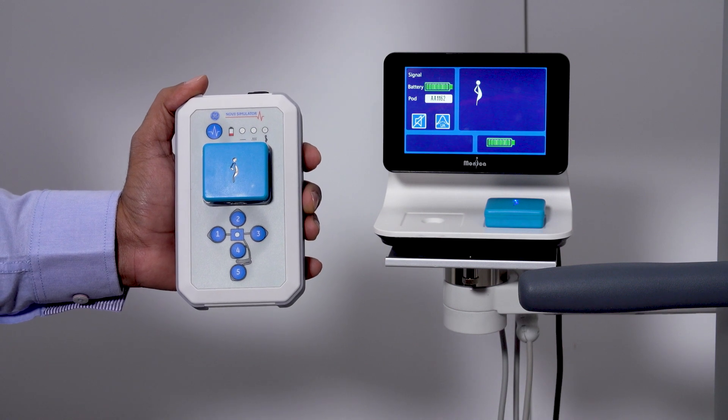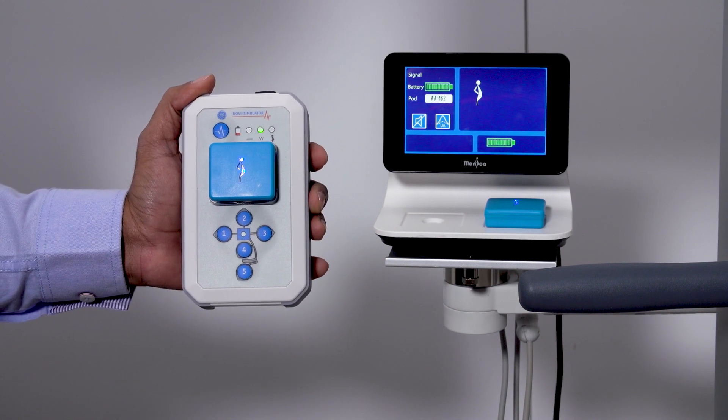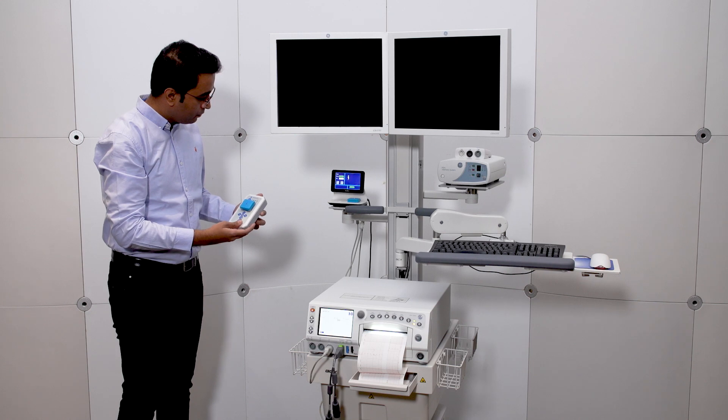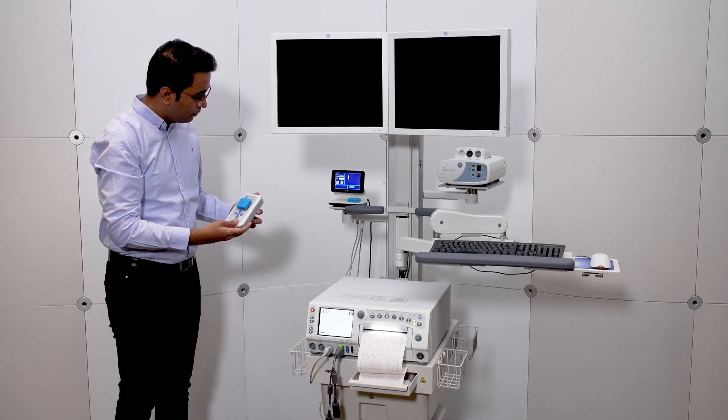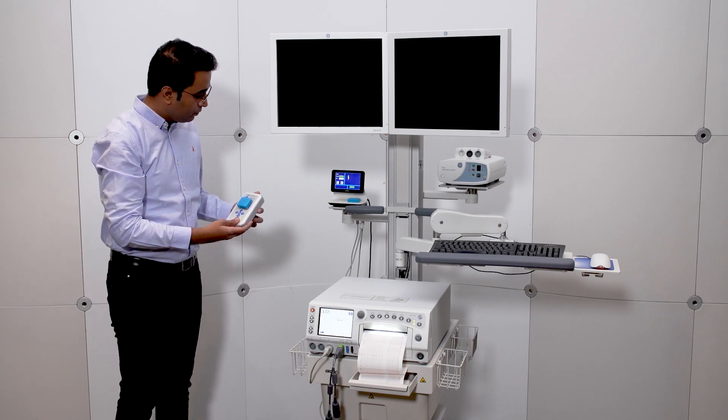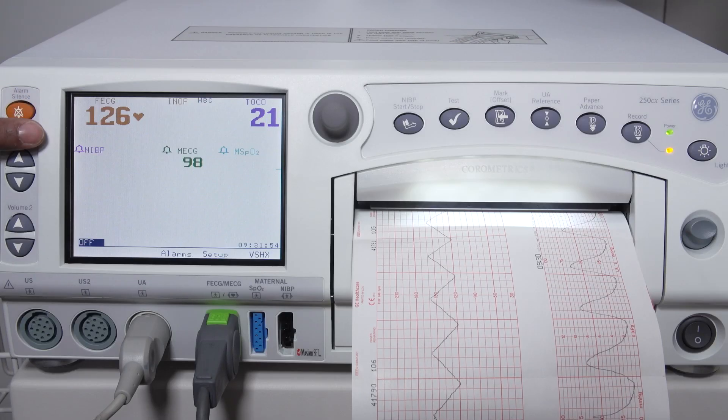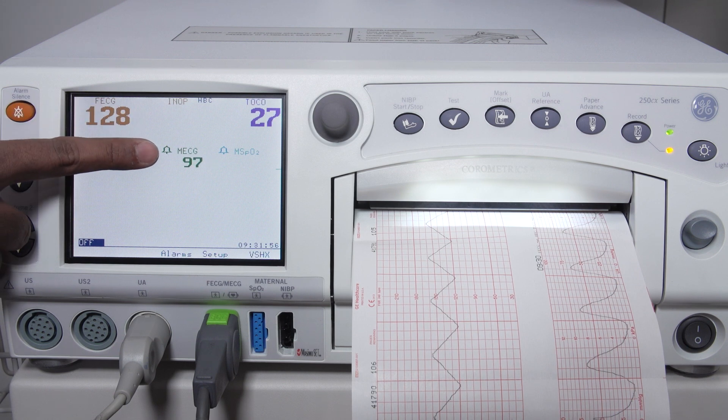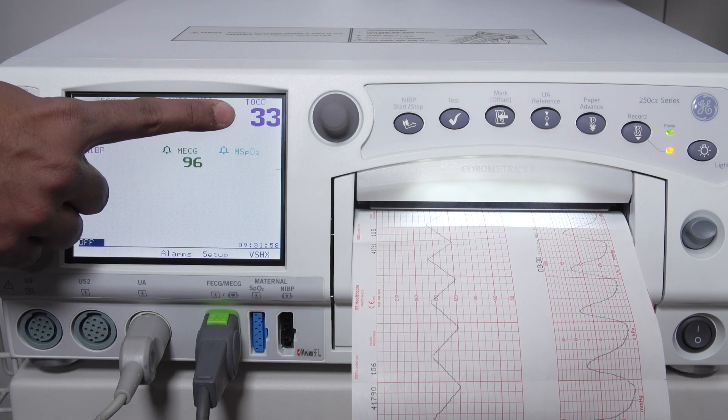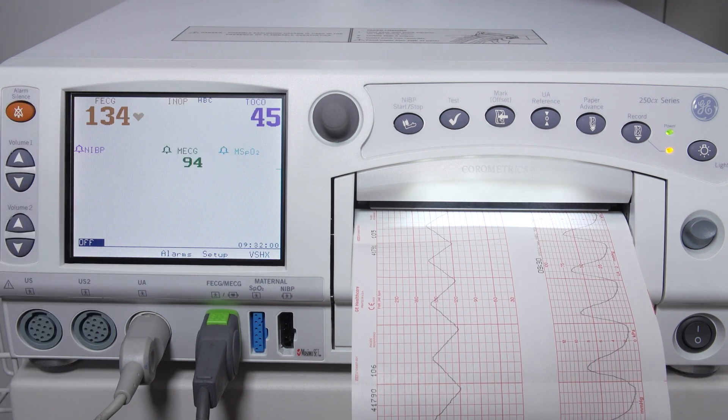Wait for the Novi monitoring to start. Be patient. When monitoring starts, the fetal heart rate quality indicator turns green. And the fetal heart rate, maternal heart rate, and uterine activity values are displayed on the Corometrics display screen.